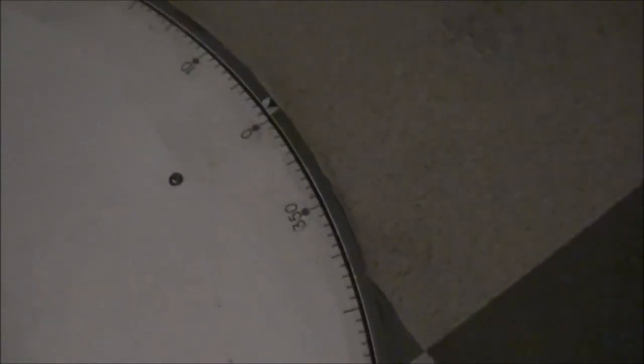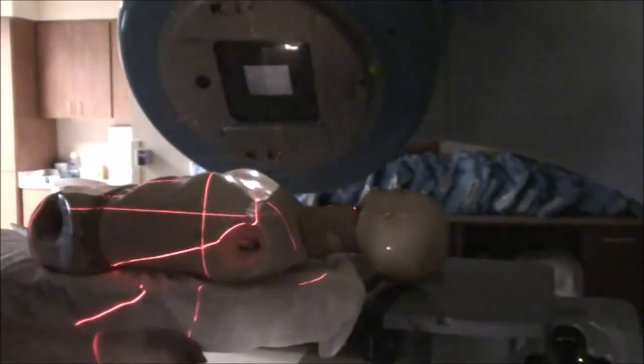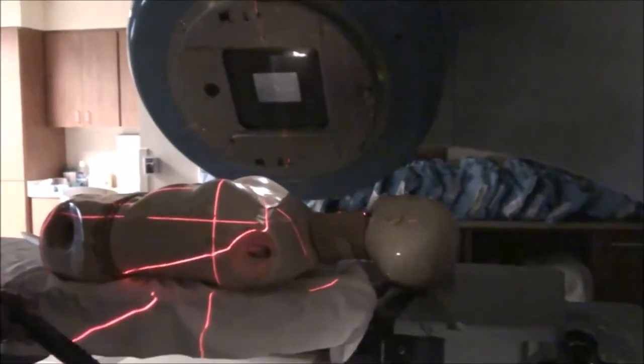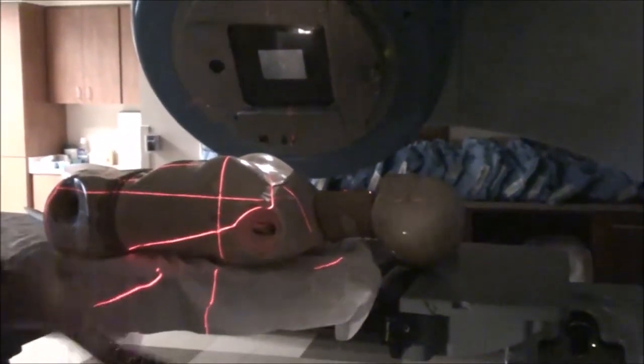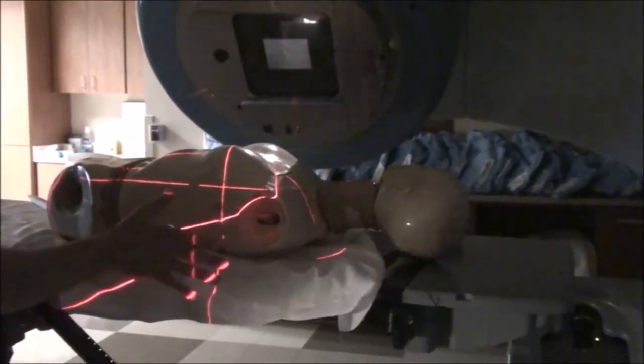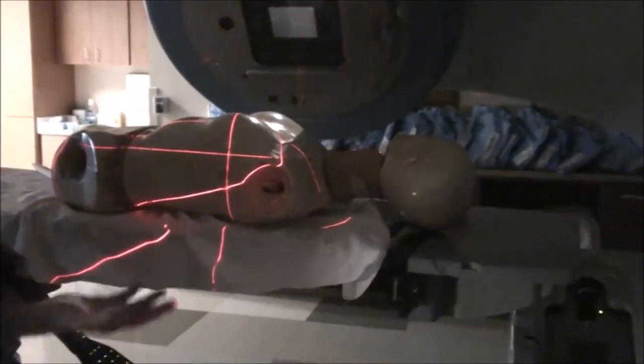Once it's approved, you have to move the entire gantry around to the opposite angle. You have to mirror your table — that's the one thing that's going to be different. I'm six degrees off on the table, so you want to be six degrees the opposite way. Then rotate your gantry around. Watch your image intensifier coming around the back side — you can hit the image intensifier coming around; you can also hit the patient's arm with the collimator head coming around this way. Since you've already notated your table settings, you know you can move the table, clear everything, don't hurt your machine, don't hurt your patient — not necessarily in that order. Put the patient back where they go and then start with your lateral: check your SSD, take your film, get it approved, mark the patient up, and then you're pretty much done.